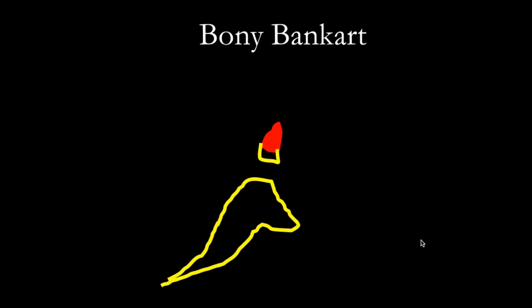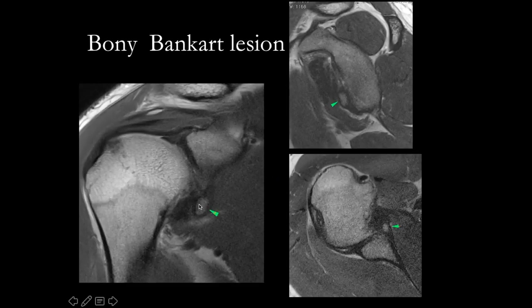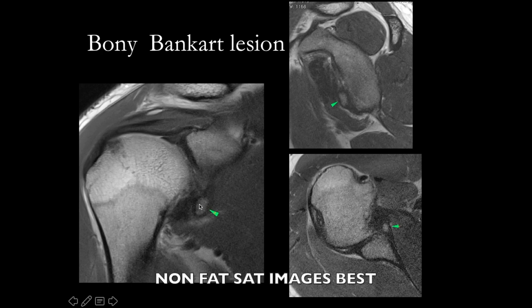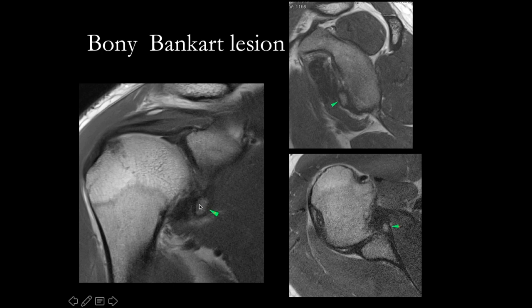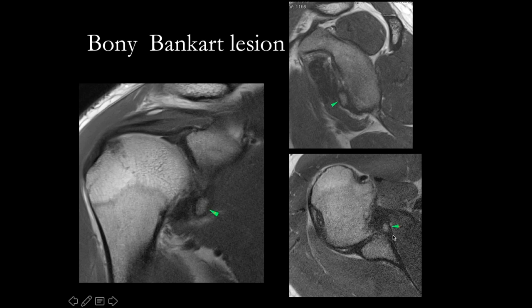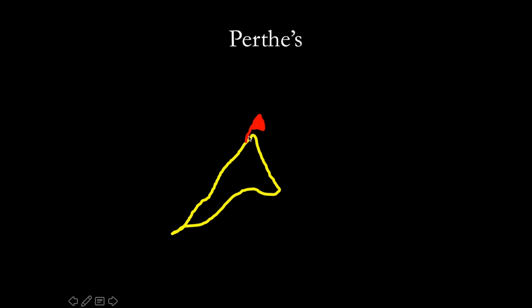Depending on the force with which the dislocation happens, if the force is more, a piece of the glenoid may also come out along with the labrum. This is called the bony Bankart lesion. Here it is very important to look at the non-fat saturated images, because on fat-saturated sequences everything is suppressed and you may not be able to identify the bony fragment well. You can see an osseous fragment coming off the anterior inferior glenoid on sagittal and coronal images. We need to give the dimension of this osseous fragment. If there is a very thin slender flake of bone, CT would be better than MRI to demonstrate that.